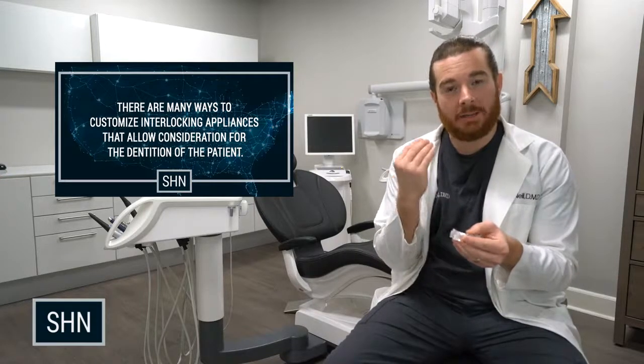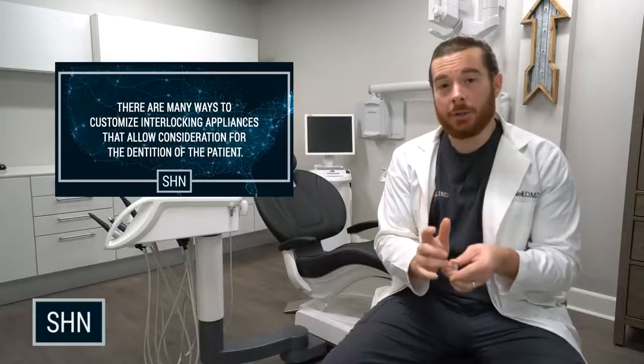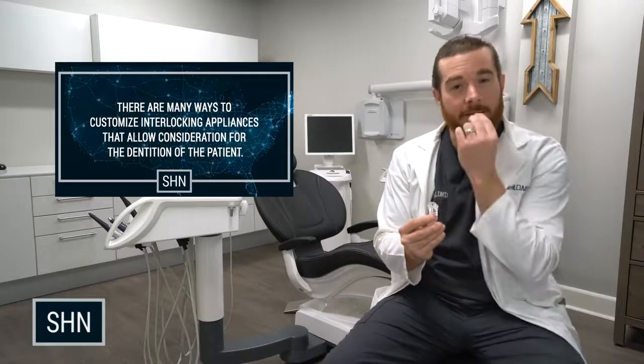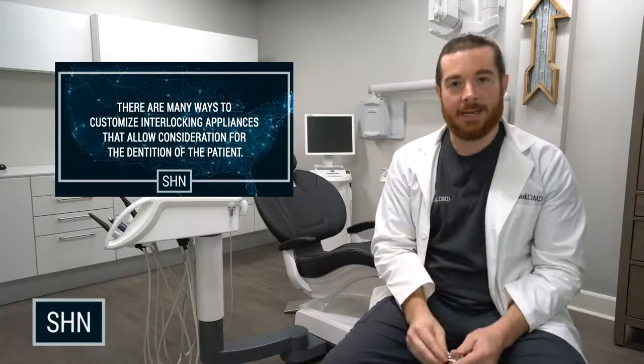Again, it's interlocking on the side. If a patient is a big time bruxer, you can give them more space so that they have some lateral play from the left and the right. You can even add an anterior discluder for your bruxing patients. What that basically is, is a solid piece of acrylic that's secured to the front, which prevents posterior contact.